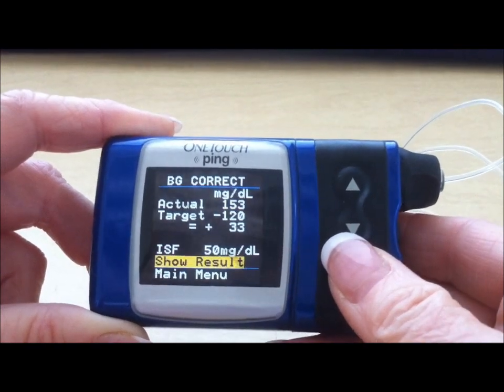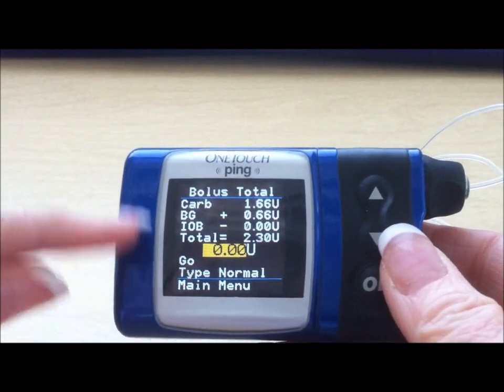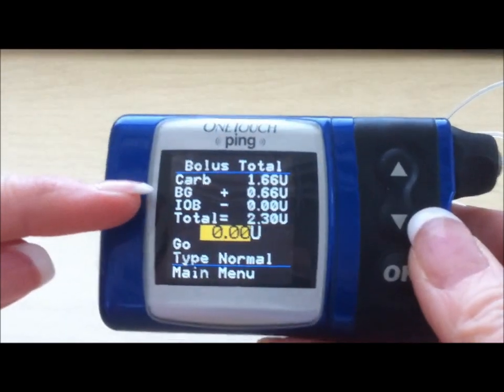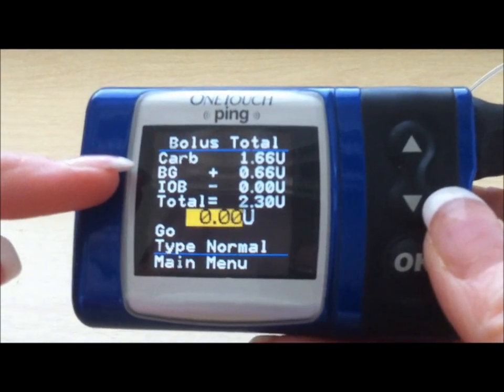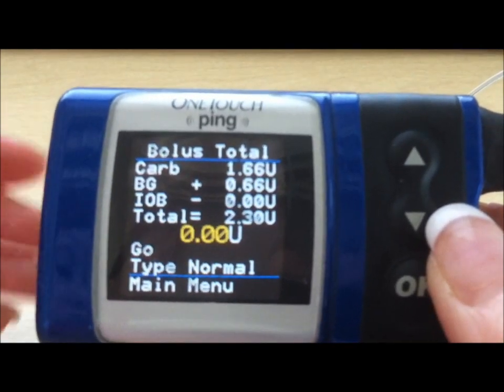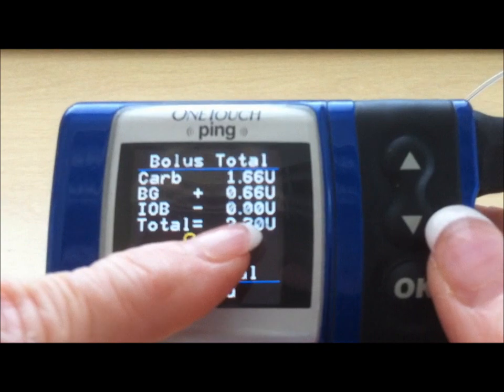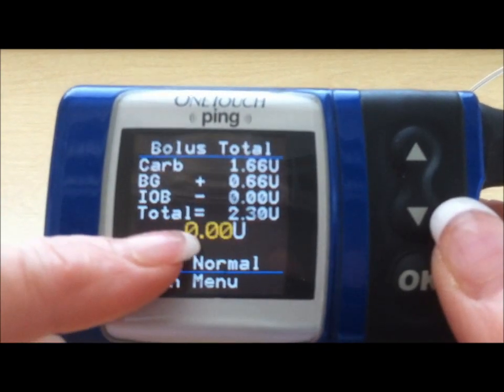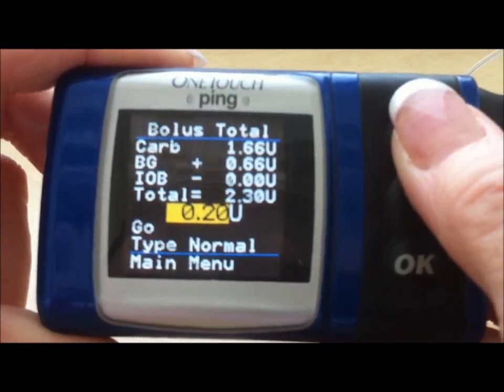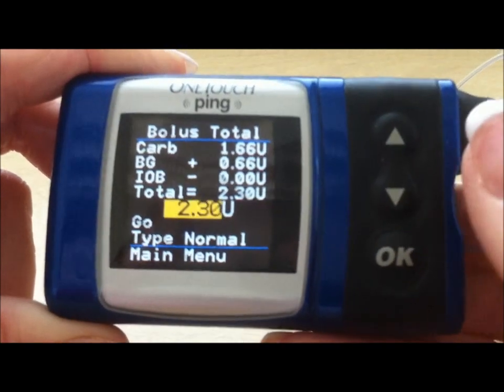You press Enter and it goes to show result. In this example, based on the settings for this person, you need 1.66 units for the carbohydrates they're going to consume. You need 0.66 units for the blood glucose. The IOB stands for insulin on board, which is how much insulin is still working from a previous delivered bolus. You have the recommended amount of 2.3, blinking at 0.00. Use the up arrow to go to the recommended amount, and if you go a little too far, you can back down to 2.3.